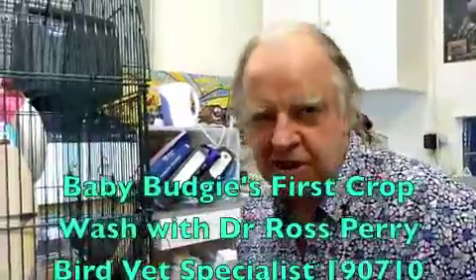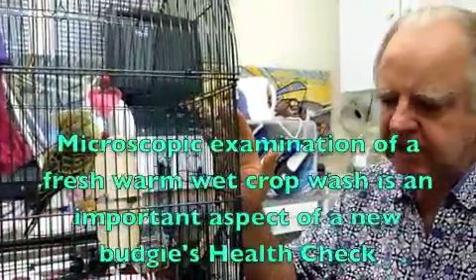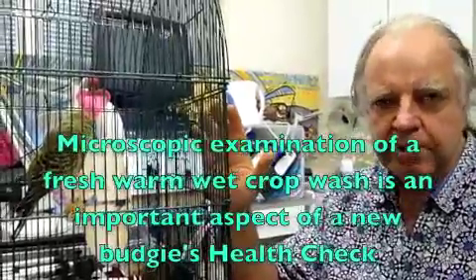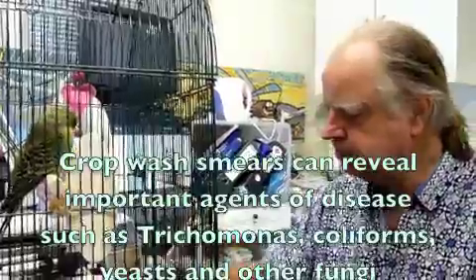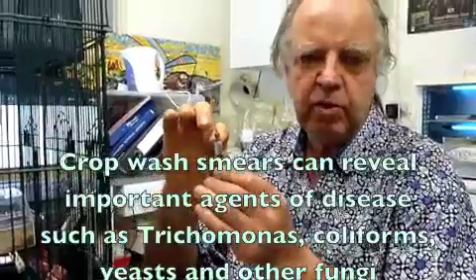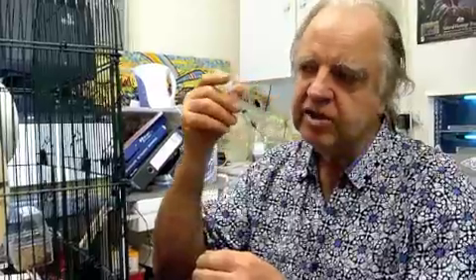What I'm about to do is extend calm to this little budgerigar, bringing calm, peace, and love. As part of its health check, I want to do what's called a crop wash, where I pass a crop tube — one of these things — with about a mil of water for injection. We're going to pass this tube down the bird's throat from the left-hand side across to the right-hand side, where the esophagus comes down the right side of the neck, and gently ease it down to the crop, which is a pouch at the base of the neck before it enters the chest.